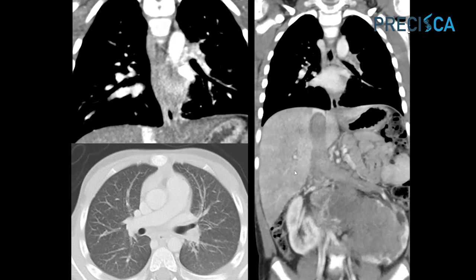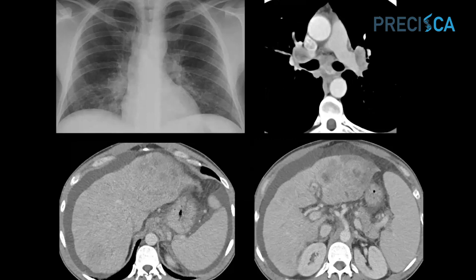That enhancement suggests that this is a metastatic tumor emboli and not bland thrombus. A reminder, bland thrombus should not enhance. If we see enhancement, especially when it follows the parent tumor, that's really a very good finding for macroscopic tumor embolic disease. Again, enhancement should not be seen with bland thrombi.